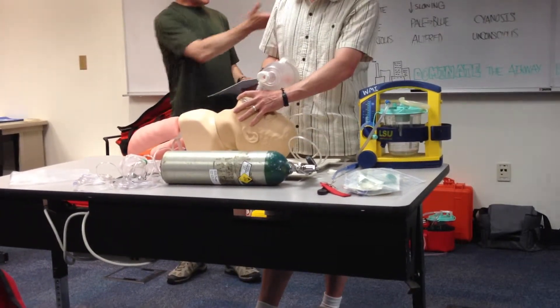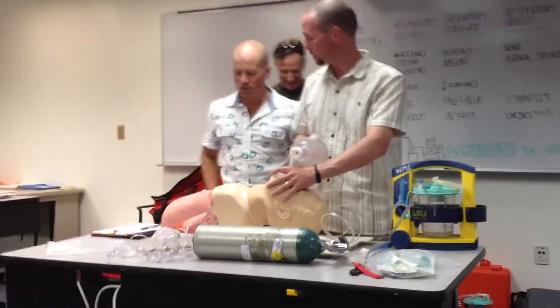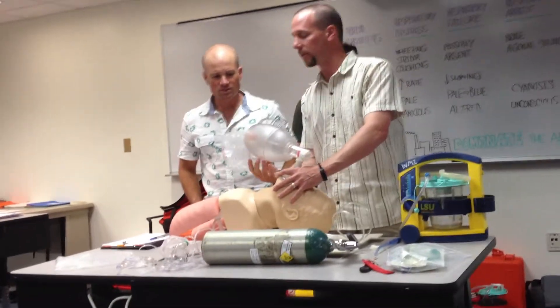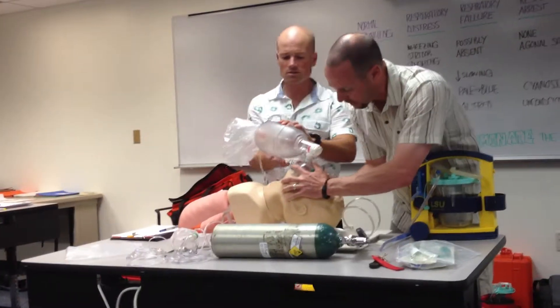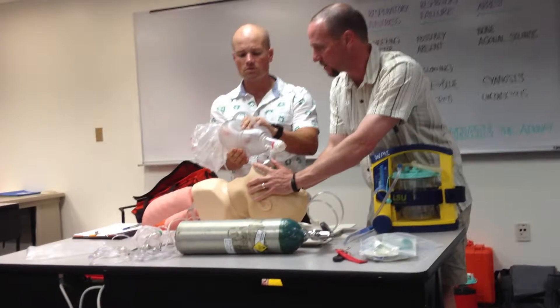We've got a second EMT that's arrived here — Gates. I have a second EMT. Although you just arrived, what I'd like for you to do is grab that bag for me please. We've got a much better seal with two hands. I'd like you to do a nice and gentle squeeze once every six or seven seconds.